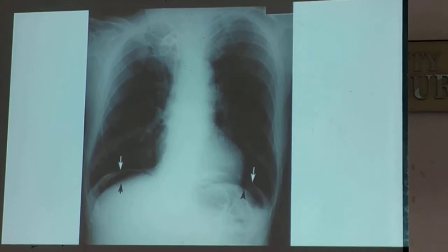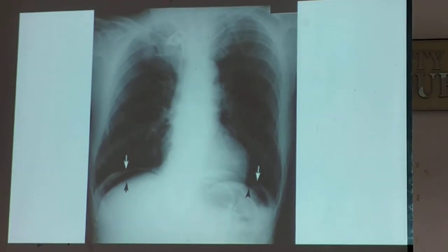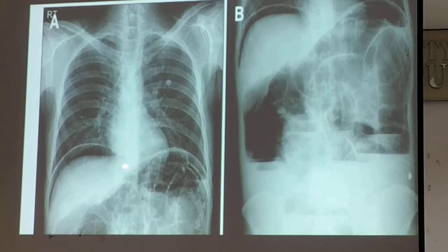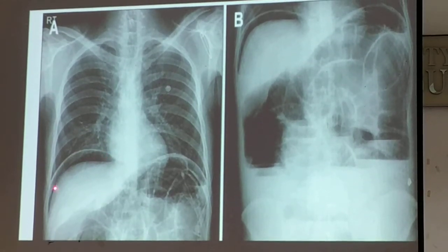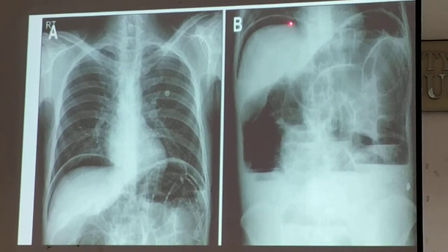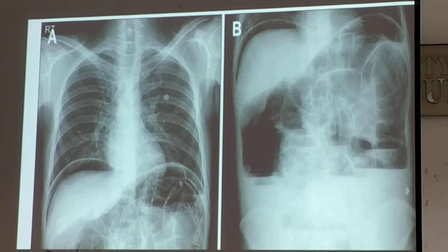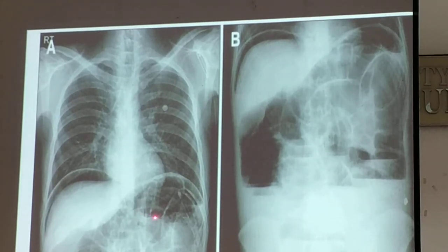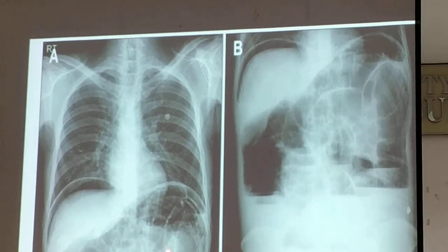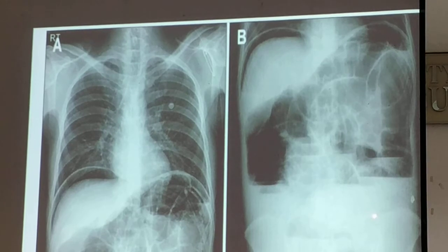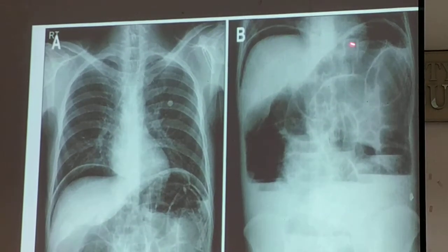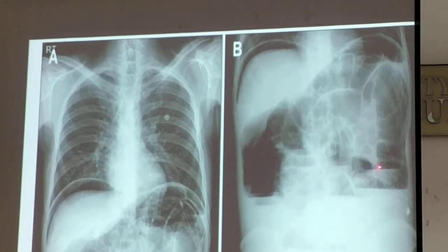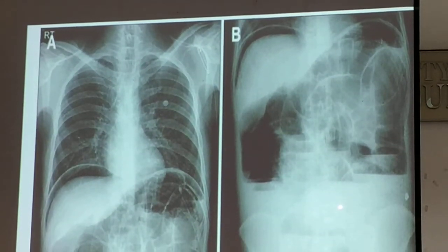Cupola — C-U-P-O-L-A. So this is a case of pneumoperitoneum. As you can see, first they requested chest PA; then they requested an upright flat plate of the abdomen because you cannot establish a diagnosis of bowel obstruction on supine alone. There is air-fluid level, so aside from pneumoperitoneum, there is also bowel obstruction.